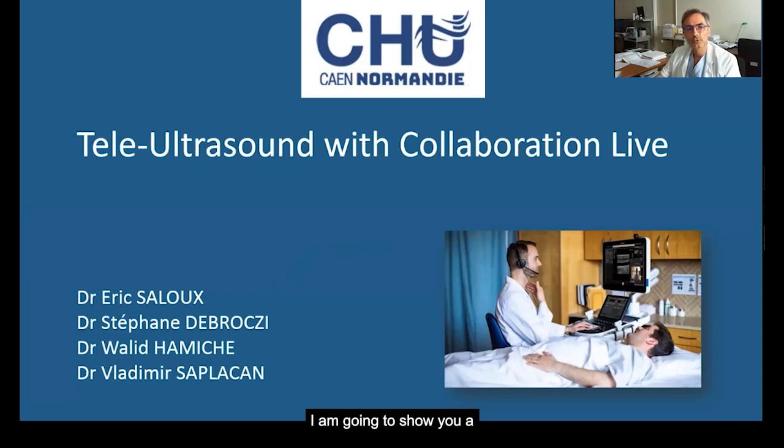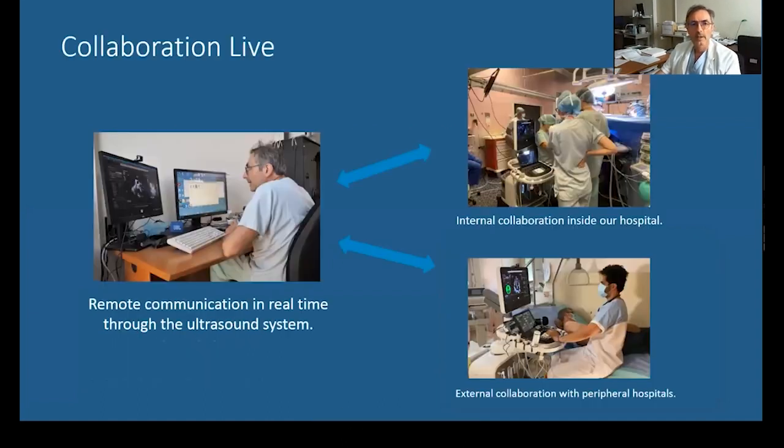I am going to show you our first experience of tele-ultrasound using Collaboration Live. As you know, echocardiography is done every time and everywhere by many colleagues with different levels of expertise in this field. So, in our daily practice, we often need to give feedback about some exams. Our colleague can ask for feedback during the exam or after, but in this case, the patient is no more available if we need to perform our acquisition. So, we will have to redo the exam.